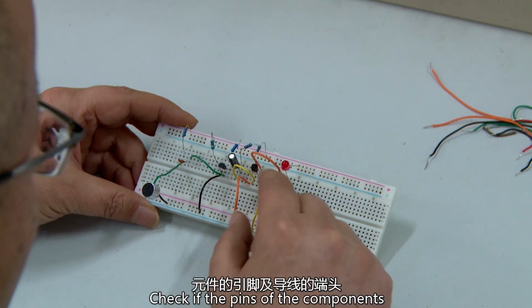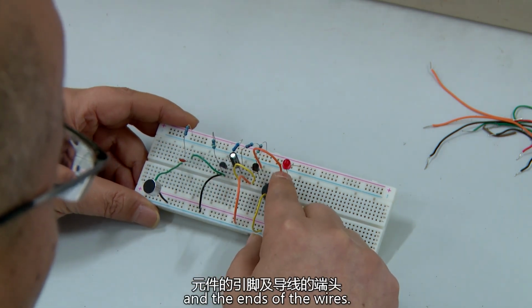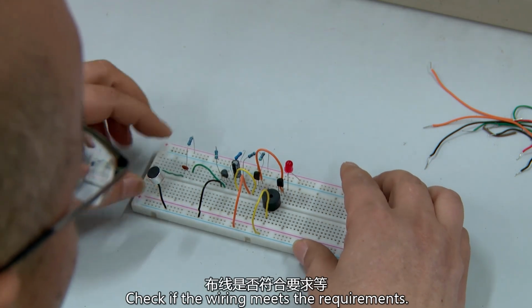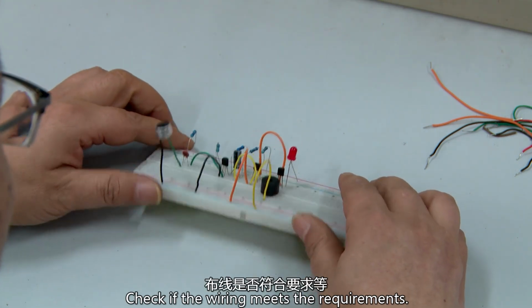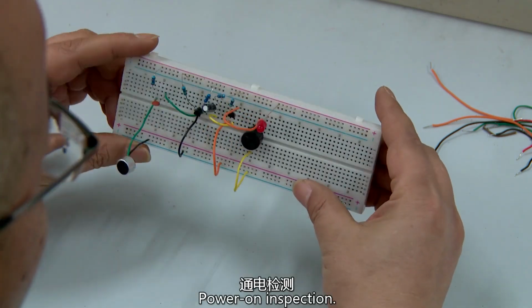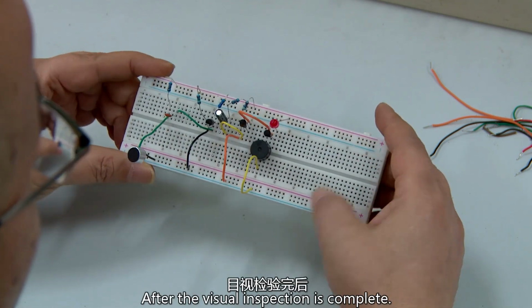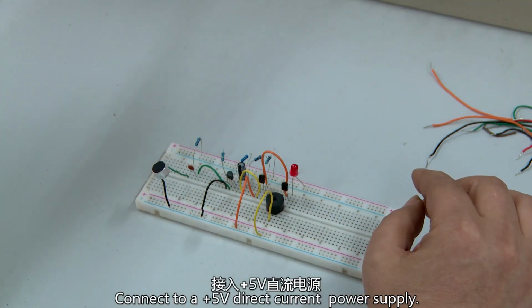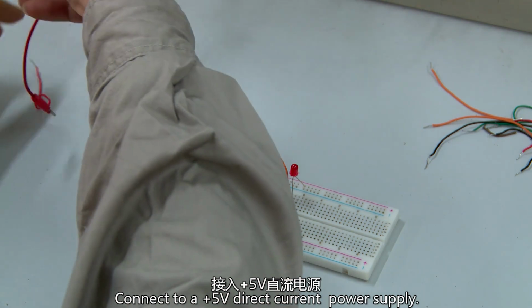Check if the pins of the components and the ends of the wires make good contact in the breadboard socket. Check if the wiring meets the requirements. Power on inspection. After the visual inspection is complete, connect to a 5V direct current power supply.